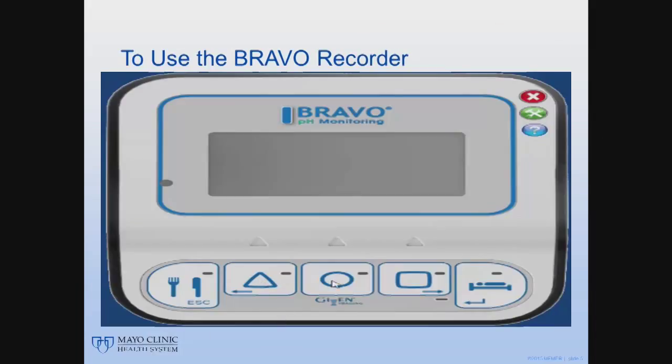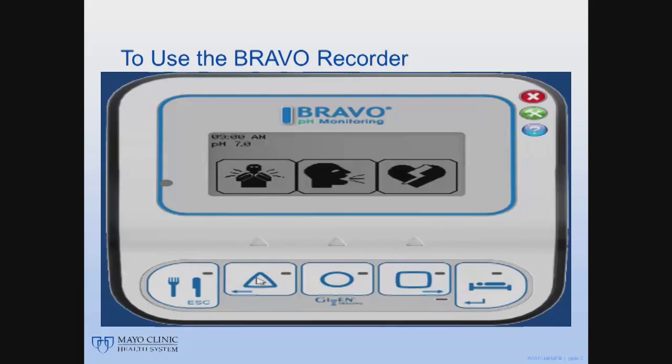To use the recorder, you must first wake it up by hitting any button to make the screen appear. Once the screen background appears, use the buttons at the bottom of the monitor to record symptoms you are experiencing. You will get a sheet to show you which buttons symbolize which symptom. The triangle equals chest pain, the circle equals regurgitation, and the square equals heartburn.